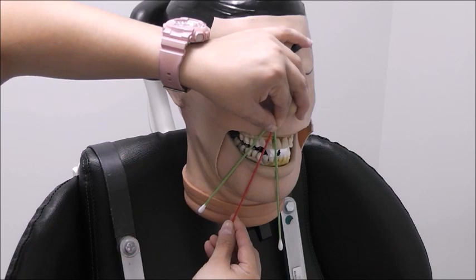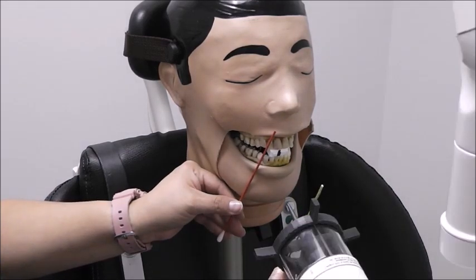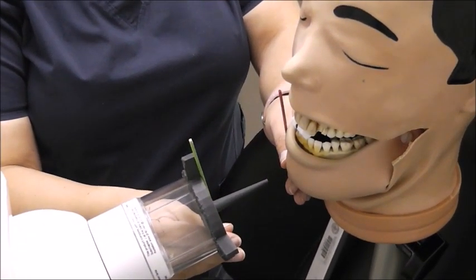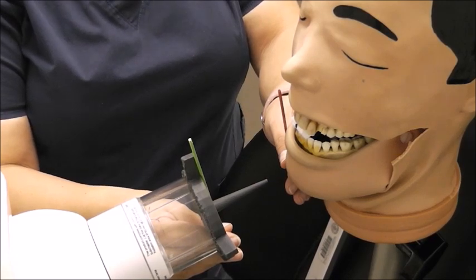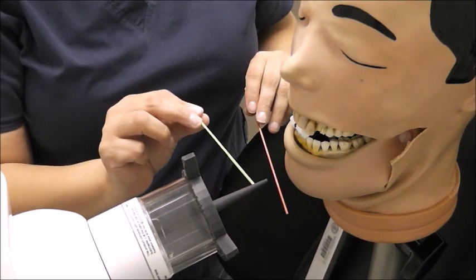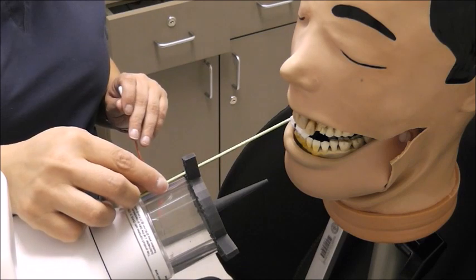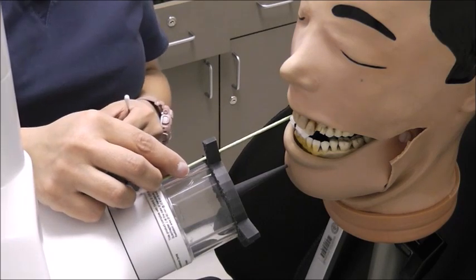Now parallel the collimator to the bisecting angle. This is your vertical angle — make sure those two are parallel. This is your horizontal angle — make sure those two are parallel. Find the central ray to make sure it's in the center of the plate. Double check that the collimator covers the plate on the top. Now we're ready to expose it.